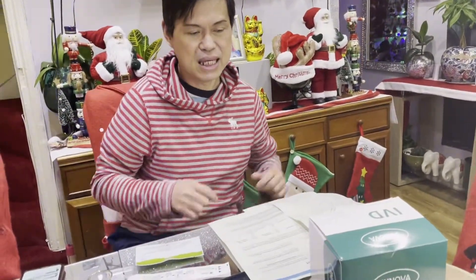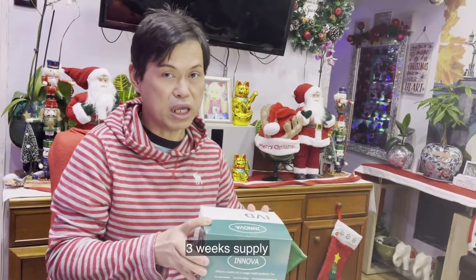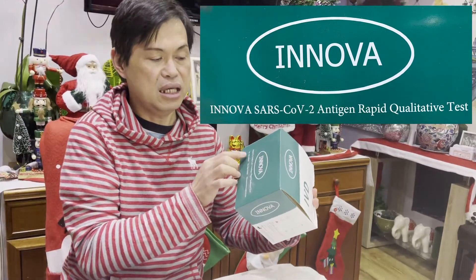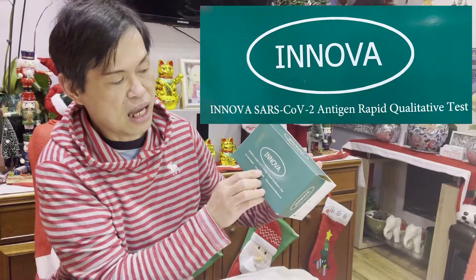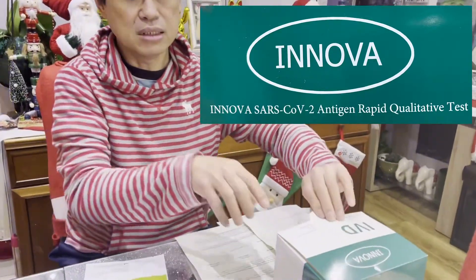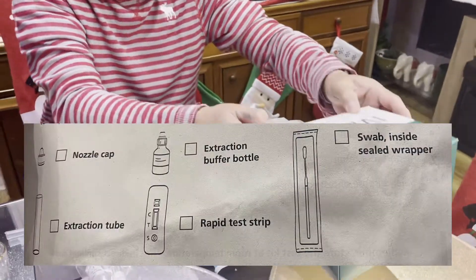In this video I'm going to show you how to do a self-test for the coronavirus using a lateral flow device. We are being supplied for three weeks for healthcare workers, and this is for the antigen — the Inova SARS-CoV-2 antigen rapid qualitative test.